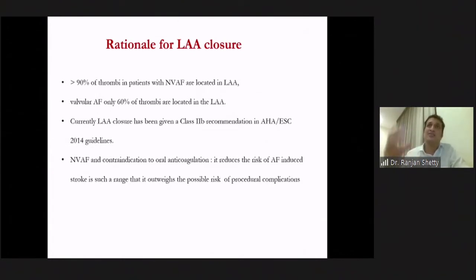So even with the best of the drugs, up to one quarter to one third of patients don't take it for reasons other than finances. That means they are not able to tolerate it, and there's also a 2% risk of bleed. There's a distinct group of patients who have not been studied in any of the trials, and that is people who have already bled. There is no trial in this group. In this group, it is believed that LAA closure is the only option, but to be honest, there's no trial for this group.